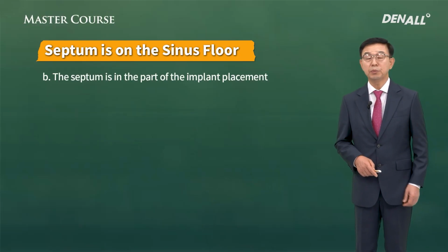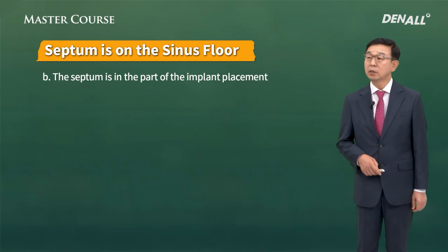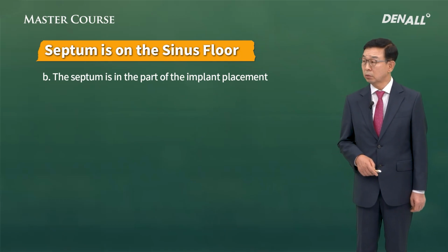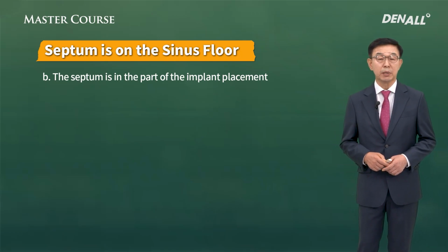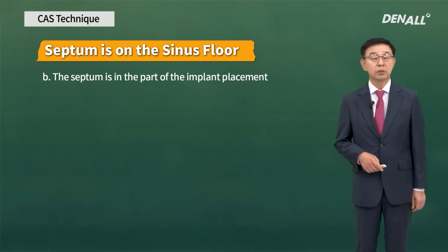At times, the septum can be in the implant placement position. In general, with the method using an osteotome, it becomes very difficult. Because malleting is done, the patient can be traumatized. If you use the CAS kit appropriately, you can do the crestal approach without causing trauma.